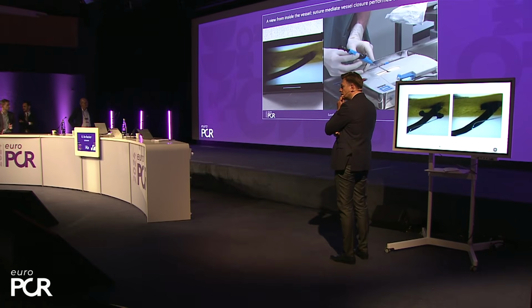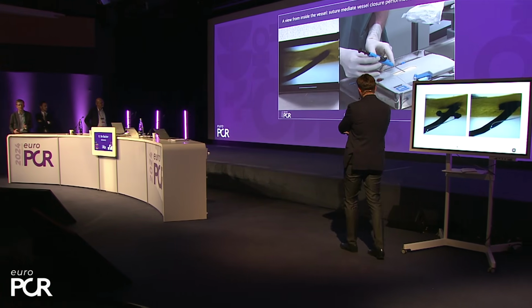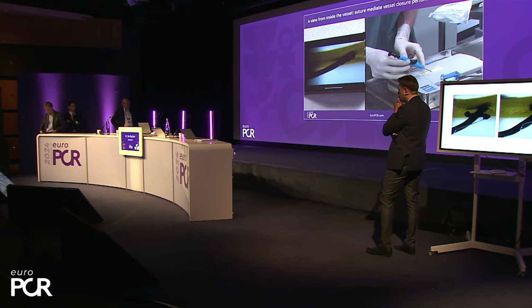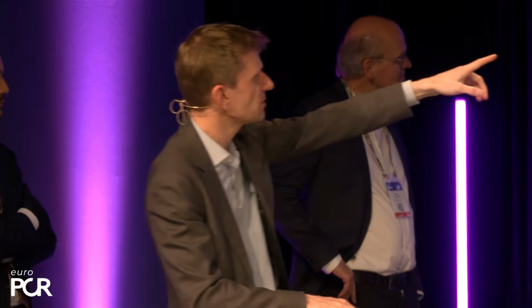I also see some people, young fellows, for example, who do this for the first time. They don't respect the axis of the artery, especially if they're working on the left side. They go in like this. No, try to follow the axis of the artery. Then you see a bleed back on the side port. If you see that, that's important that you see that.